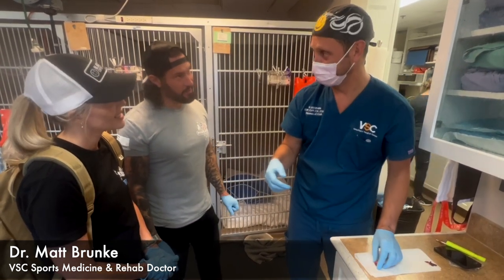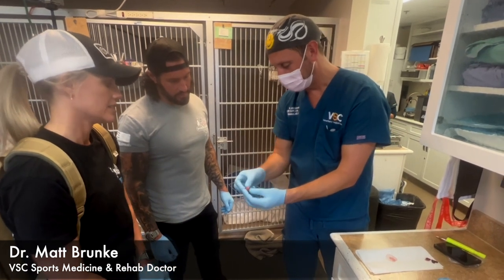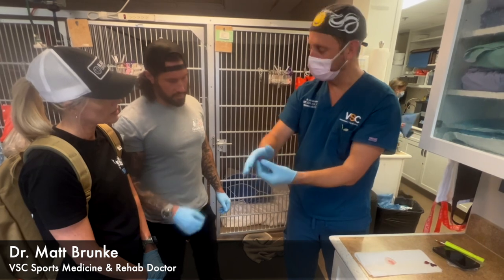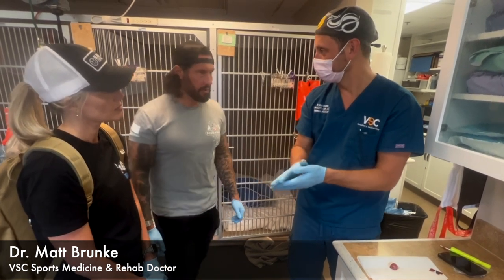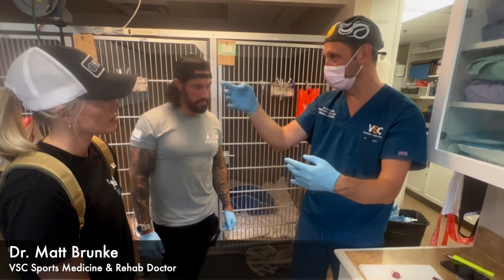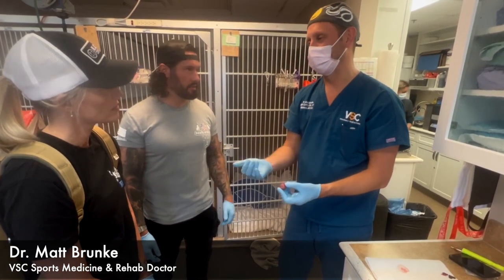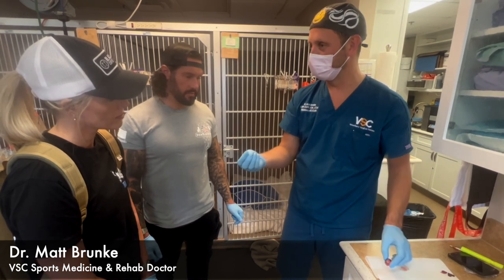That's what Hurricane is dealing with — something that's just uncomfortable. There's no cartilage left; it's all bone with no padding. The PRP would kind of coat it, smooth it out a little — we can get some better healing and calm down that joint capsule called the synovium. When you get inflammation of that, it's called synovitis, and that's what looks like sea anemones on the scope — just stuff that's rubbing all the time. The cartilage doesn't have nerve endings, but the reason arthritis hurts is because that synovium has all the nerve endings in it.